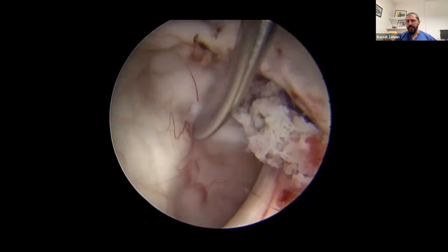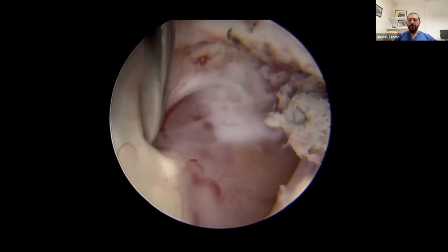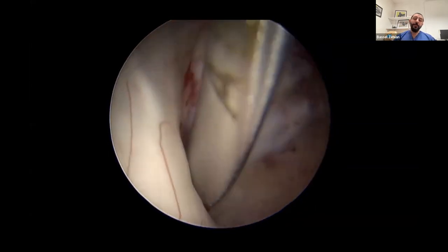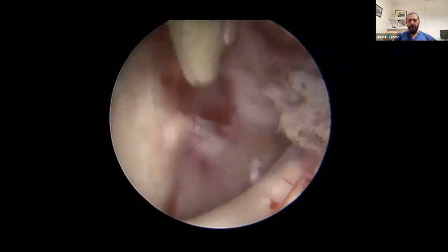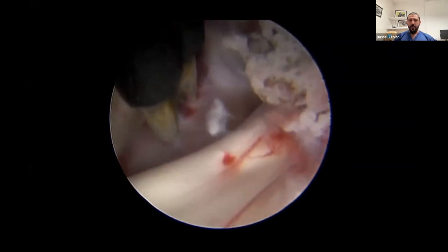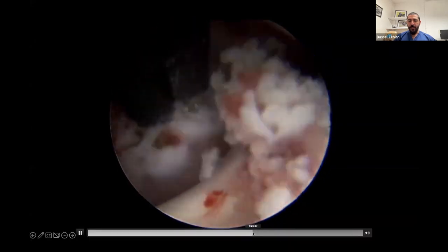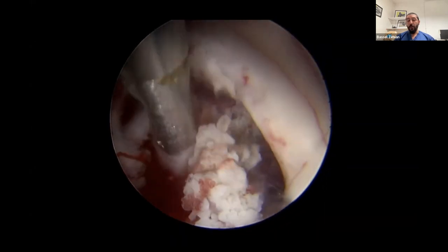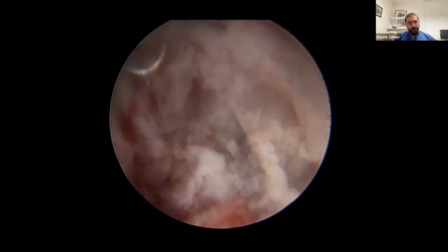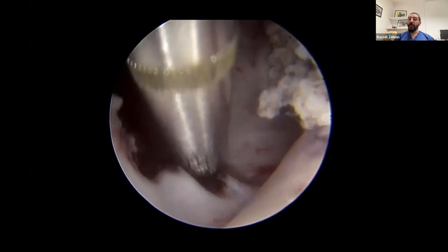I think the major trouble is when you're really going to town and trying to lift the fornix up. In those who have already got memory problems, they can transiently worsen and then get better. This is where it's attached to the hypothalamus, essentially, although we are still quite superior to that, so it's more the columns of the fornix, and it's just buzzing and separating it really, trying to get as much debulking as possible, and that using the biopsy forceps, as we said, and often with the ones that have a little rotating knob that you can just push with your finger, and it works quite nicely. But if you can't, you can ask your assistant to rotate it for you.